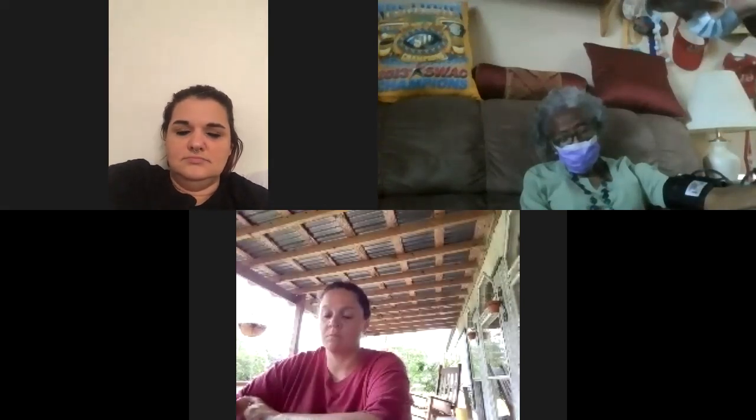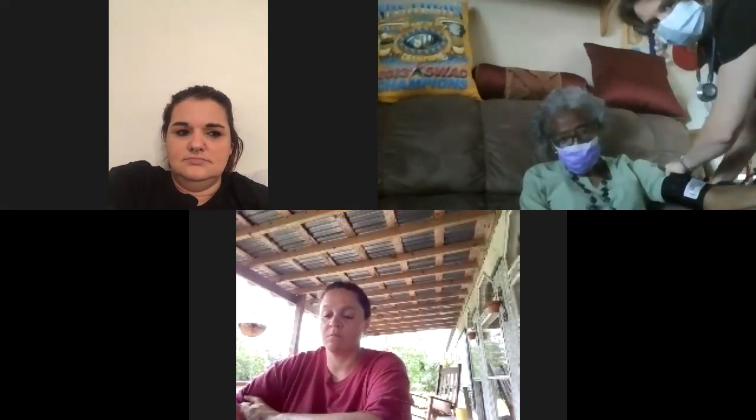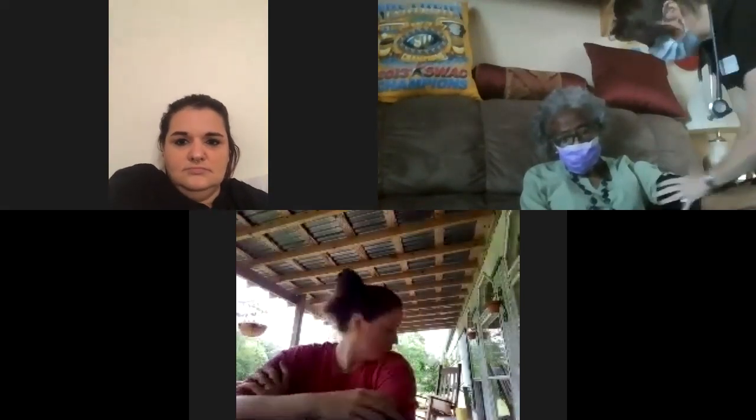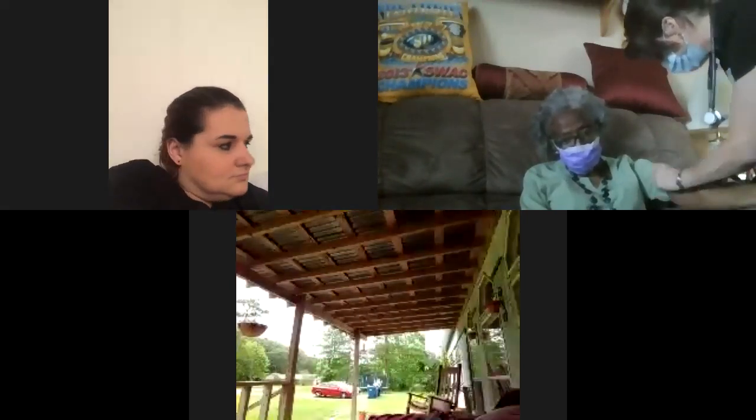104/60 is your blood pressure. Does that sound right to you? Uh-huh. Okay. So I'm going to explain to you the readings of your blood pressure. I'm going to take all of this off of her. I'm going to fix her sleeve. Is that comfortable? Okay.